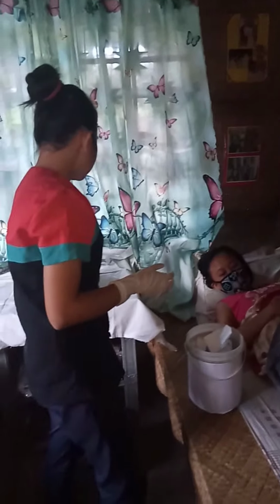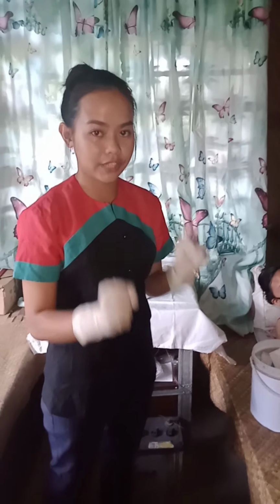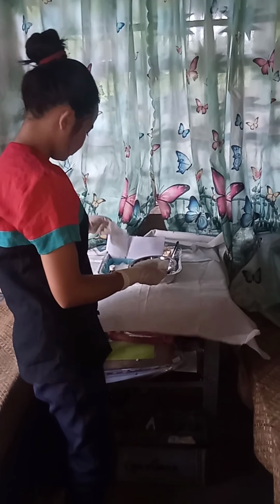Then after that, it is the time to apply 4x4 flat gauze, cut to fit around the drain, if present. Pre-cut gauze is also available.